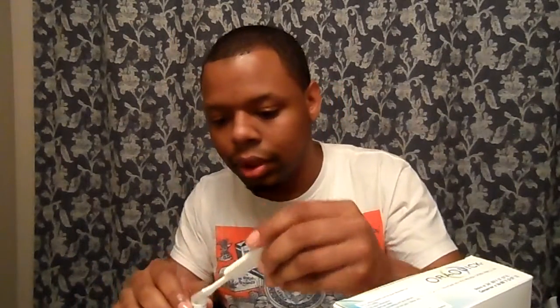It came in this box and the presentation was really cute — I felt like I had bought an Apple product, it was so expensive-looking. I'm gonna repack it so I can show you. It comes in this cute little pack.